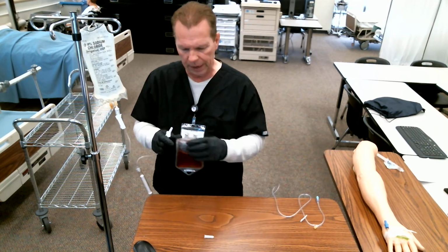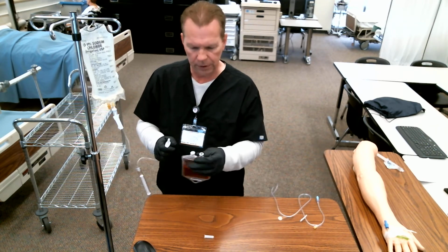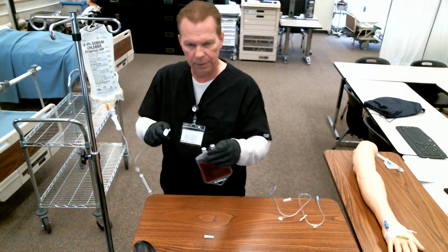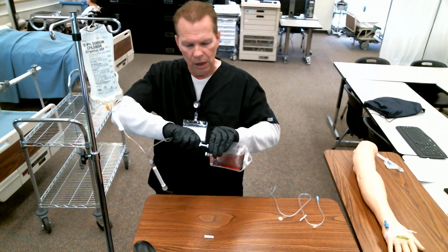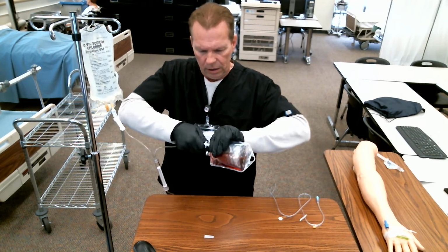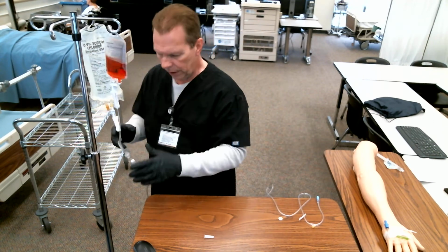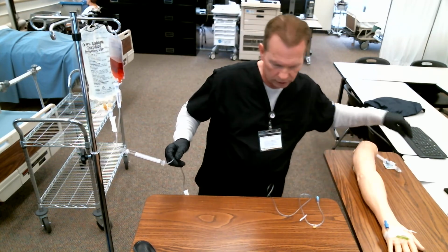And so now I'm going to spike my blood. And I'll pop the top off there. So that's a sterile end. Don't want to touch that with anything contaminated. Here's the sterile end. So I've got my cap off now. I'm going to bring the 2 sterile components together and put that in there. Okay. So now I'm ready to get this adjusted and get this set. I'm going to move my junk out of the way there.